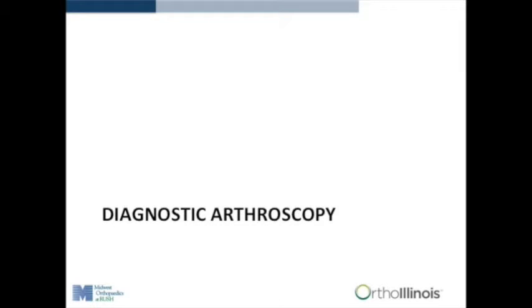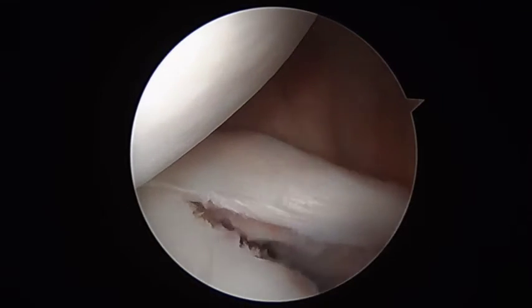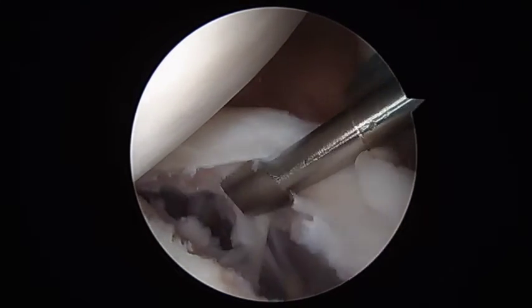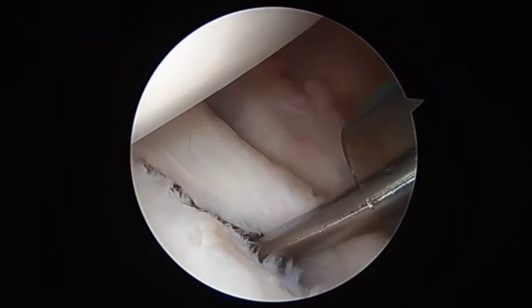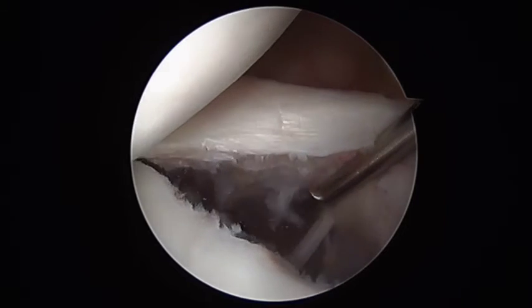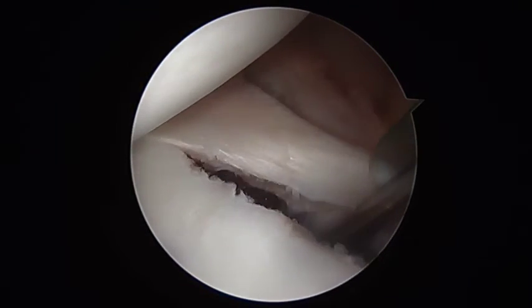The patient was taken to the operating room and placed in a lateral decubitus position using a traction arm holder. Examination under anesthesia was performed, revealing grade 3+ shift in the anterior superior, anterior middle, and anterior inferior directions under load. There was also a grade 1+ posterior translation with the load and shift test.